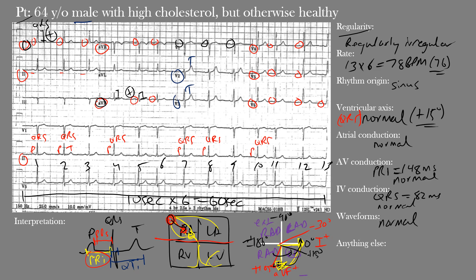Is there anything else we're missing? The R wave progression in the precordial leads appears normal. R wave progression means that as we go across the precordial leads from V1 to V6 — from right to left — the R wave should increase in amplitude, because we're moving toward the dominant left ventricle. The R wave is the first positive deflection after the P wave. Notice how the R wave increases from V1 up to V5, which is what we call normal R wave progression, and we see that here.